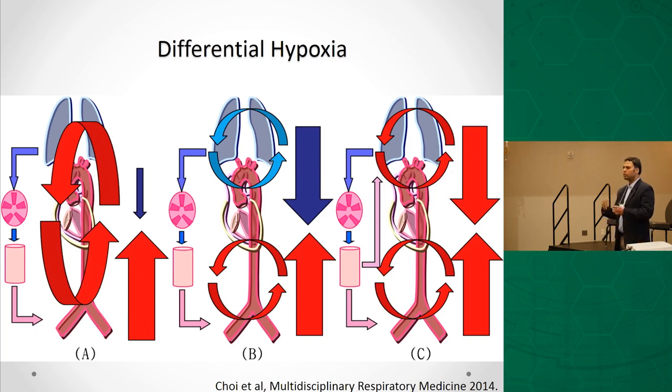So that they could change the zone of mixing by artificially positioning a cannula high up here. They had a short cannula that was perfusing everything from the renals till here, and a long cannula sitting in the aorta way up, jetting blood directly so that it could reach the arch. So again, different things can be used.